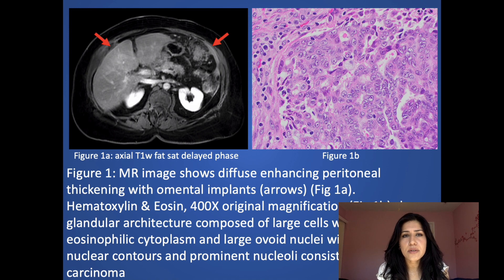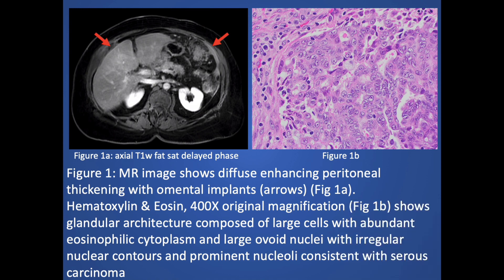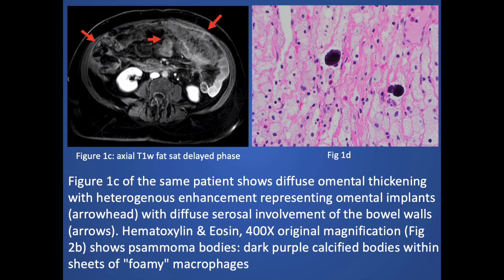I'm showing the correlation of findings between MR and pathological findings. On the MR, there is diffuse enhancement of the peritoneum with thickening and omental implants. The pathological picture shows large cells with large ovoid nuclei and irregular contour, consistent with serous carcinoma. The same patient also shows diffuse omental thickening with heterogeneous enhancement, consistent with omental implants. On the pathological picture, you can see the psammoma bodies.